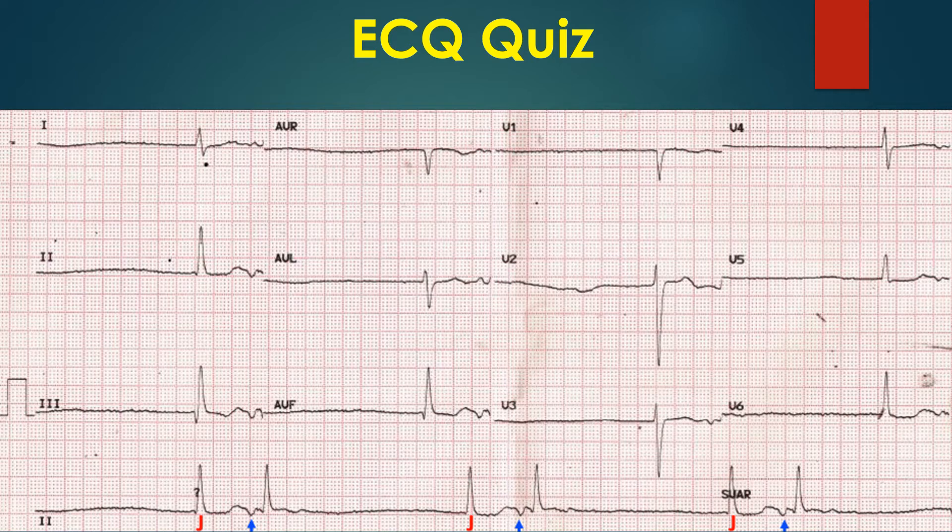In escape-echo bigeminy, the second beat is an echo beat rather than a sinus beat. The inverted P-wave preceding the second QRS could be retrograde activation of the atrium from the preceding QRS. In that case, the initial QRS becomes a low junctional beat with a retrograde P-wave occurring after the QRS. This P-wave is then conducted back into the ventricles, producing the next beat — an echo beat — making it escape-echo bigeminy, a very rare variety.